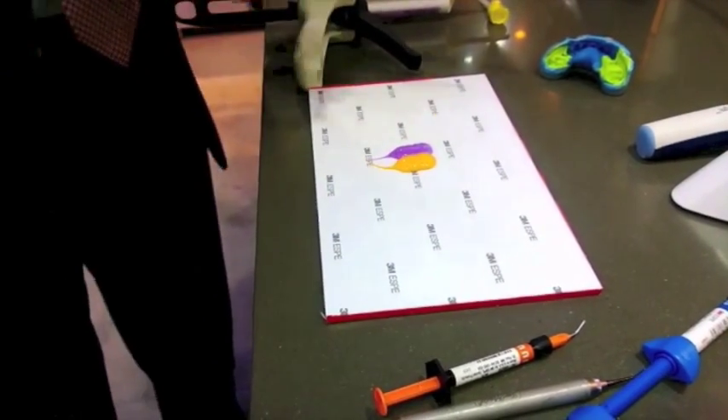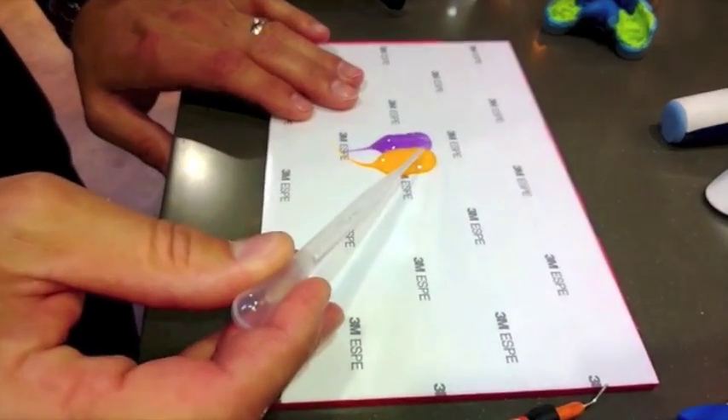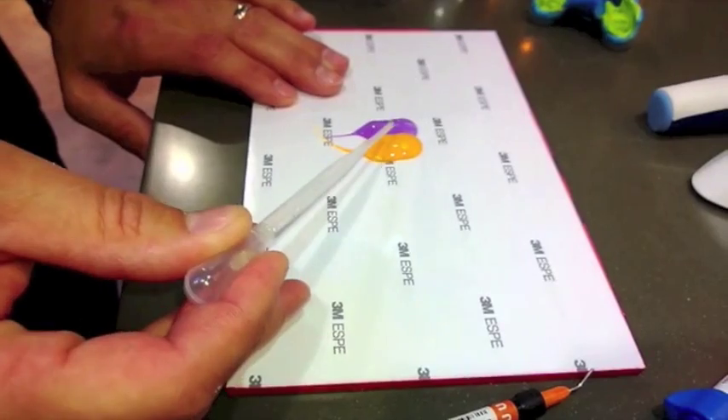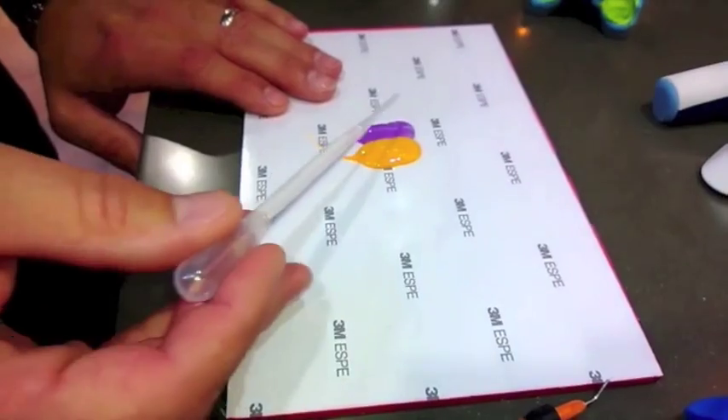Our hydrophilicity is measured in the unset state, so we're just going to drop some water and show that on the competitive material it doesn't run off, which ultimately ends up potentially being voids on the margin of the material.